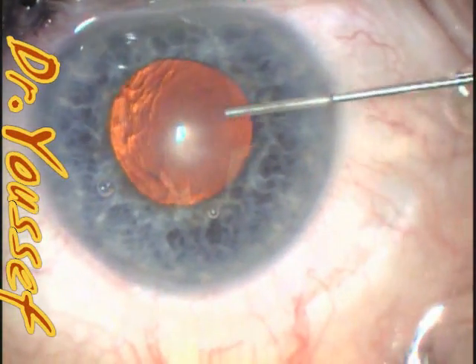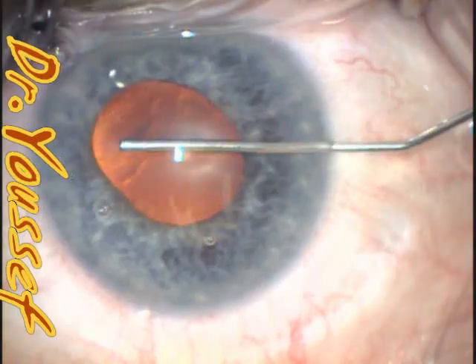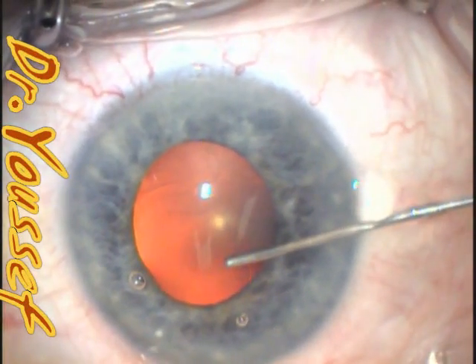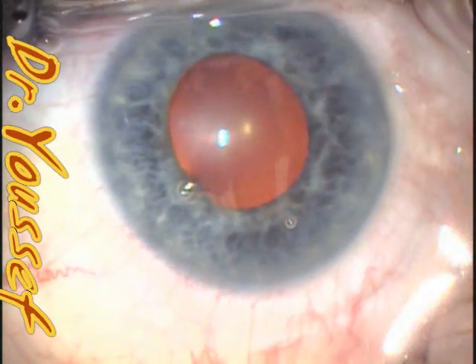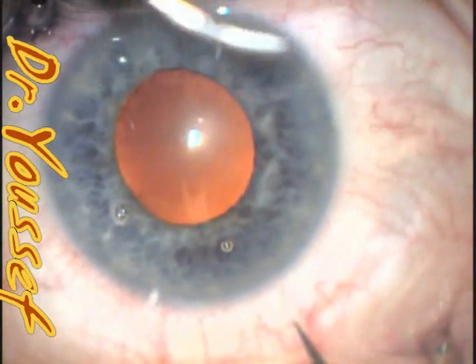Hi, I'm Dr. Youssef. I'll be showing you how to implant and explant the Malyugan ring for pupil expansion. At this stage, I'm injecting Viscote or Vitrax into the anterior chamber and I try to lift the edge of the pupil a little bit so that I can be safely implanting the ring.